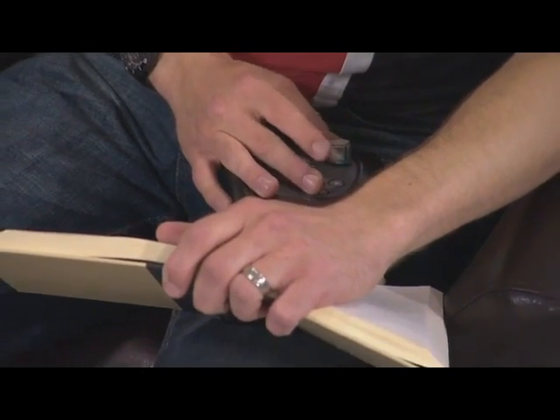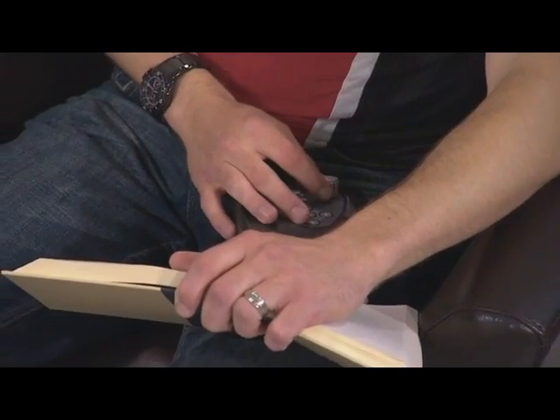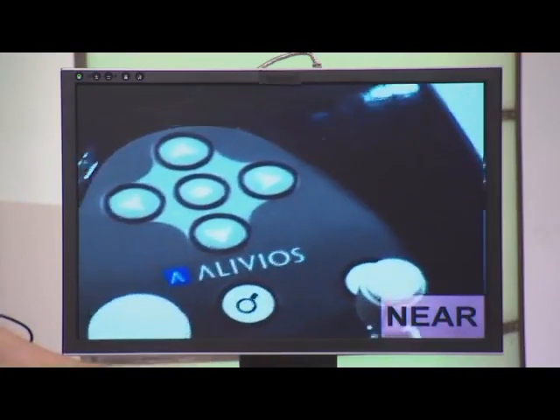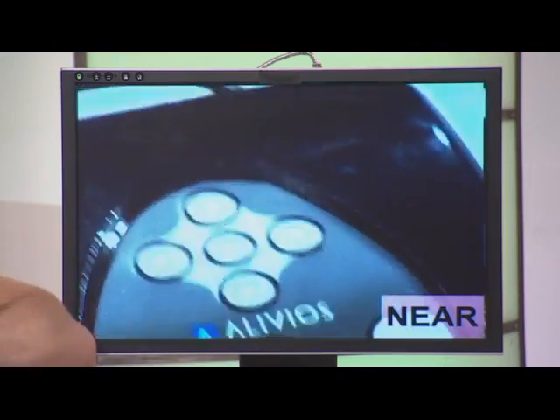Now, Frank, can you walk us through the device that Jonathan has on his lap? What exactly is he doing there, those controls? Sure. So Jonathan has a 2-piece unit. There's the head-mounted piece, and then the control piece that's below. Above, we have a camera with 2 display systems that Jonathan's looking at. There's also an ophthalmic lens that's integrated. This particular one is not customized for Jonathan specifically, but that is something that's done with the device. The user's prescription is placed in the device. And then down below, we have a control panel with 2 knobs.